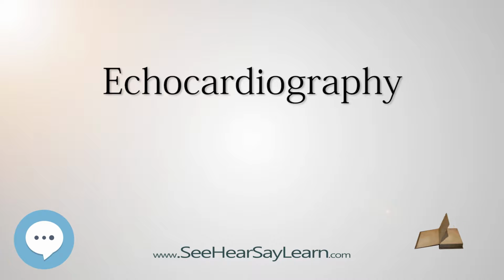Echocardiography has become routinely used in the diagnosis, management, and follow-up of patients with any suspected or known heart diseases. It is one of the most widely used diagnostic tests in cardiology. It can provide a wealth of helpful information, including the size and shape of the heart, internal chamber size quantification, pumping capacity, and the location and extent of any tissue damage.